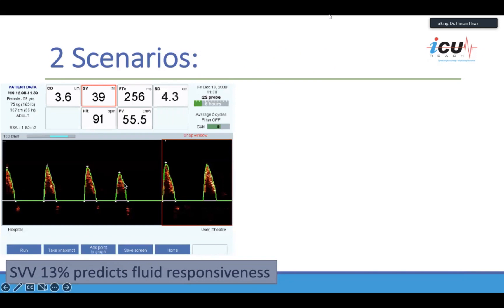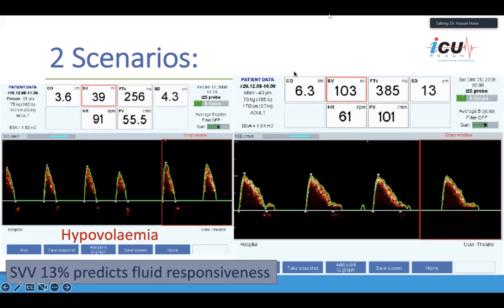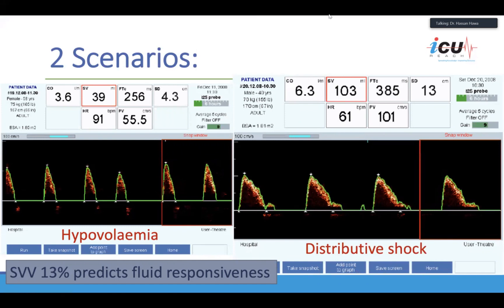Here are two scenarios shown on the ODM screen. In the first, the stroke volume is low at 39, cardiac output is 3.6 — also on the low side — and corrected flow time is 256, where normal is 330. All of this suggests the patient has hypovolemia. On the other hand, if the cardiac output is high, stroke volume on the higher side, and the corrected flow time is widened — meaning it's taking longer for blood to go through and the pulse contour is wide — this suggests vasodilation as seen in distributive shock. A stroke volume variation of 13% has been found to predict fluid responsiveness.